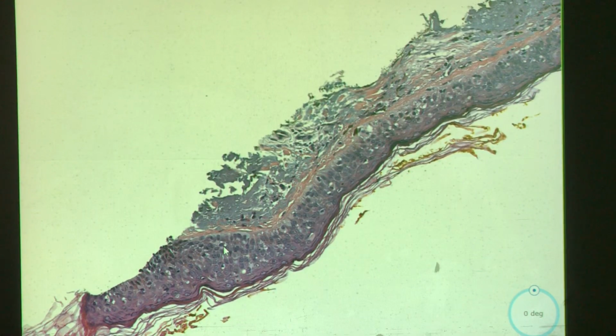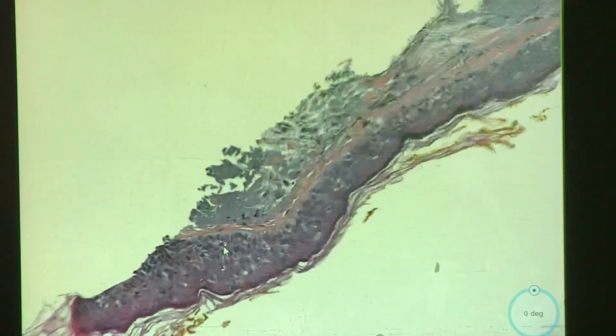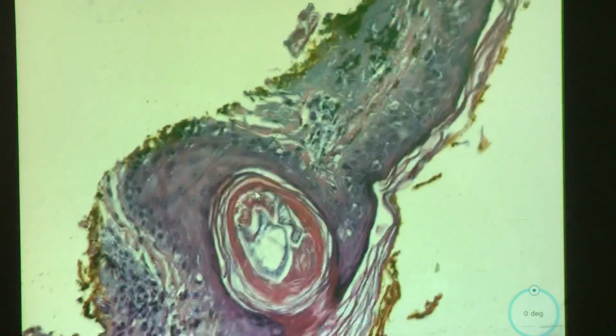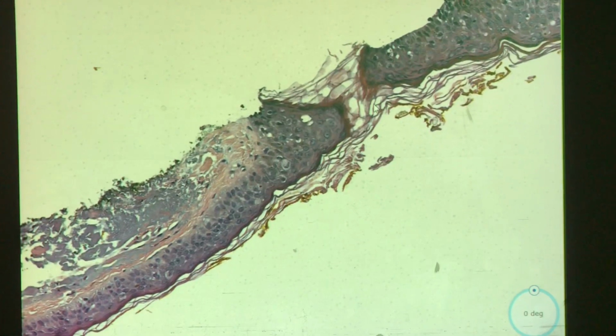How does this gross lesion look? Grossly, it's going to be an irregularly shaped macule. Ooh, alarm bell. It looks like it's mostly confined to the epidermis, so I would say it's an in situ process, probably. And since we're going to the malignant and pre-malignant cases, I'm going to hedge my bets on melanoma in situ of some kind.